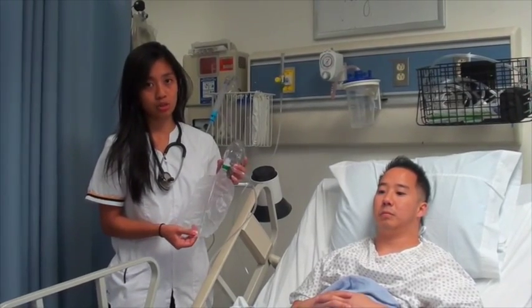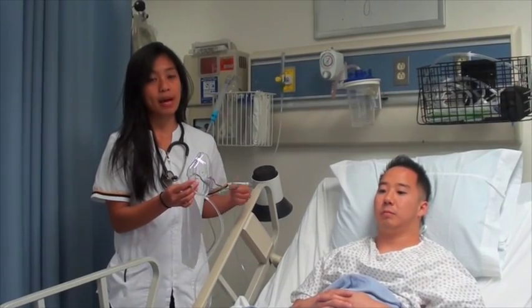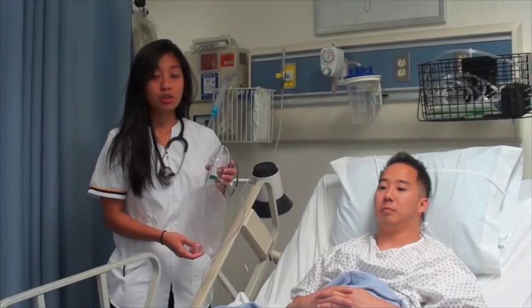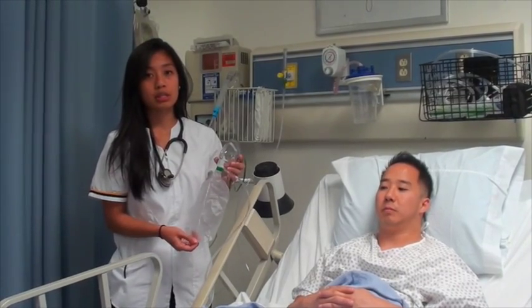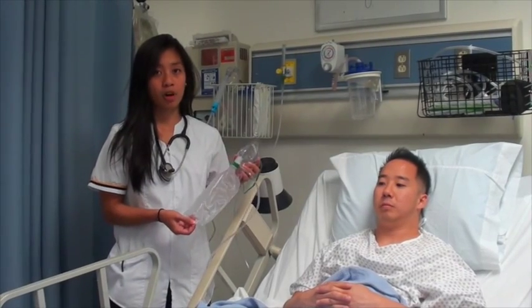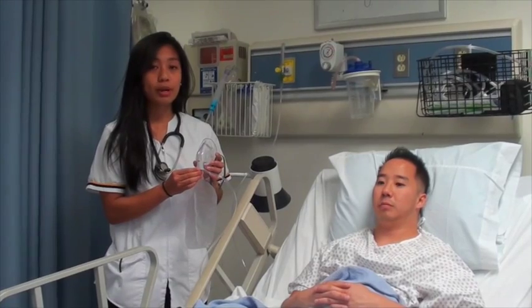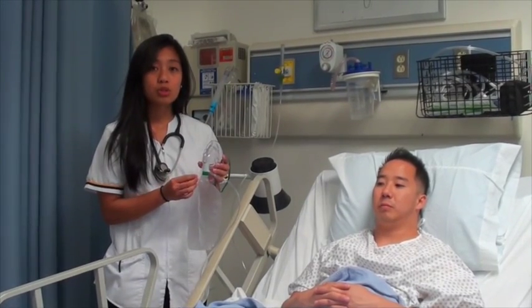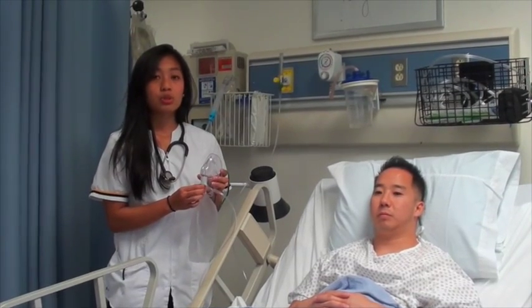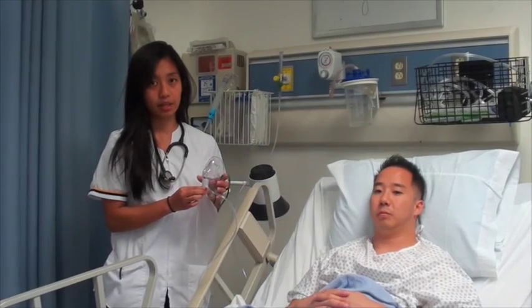in conjunction with flowing oxygen. Before you put the mask on the patient, you want to make sure that the oxygen flow rate is sufficient to keep the bag from collapsing. This prevents buildup of carbon dioxide in the bag. The mask also has a one-way valve that closes during exhalation and opens during inhalation to ensure that a high oxygen concentration is being delivered.